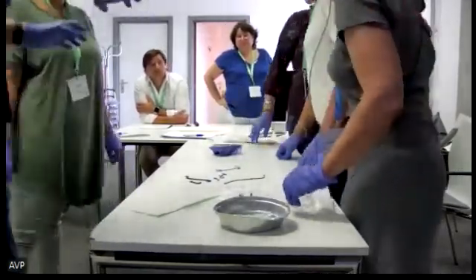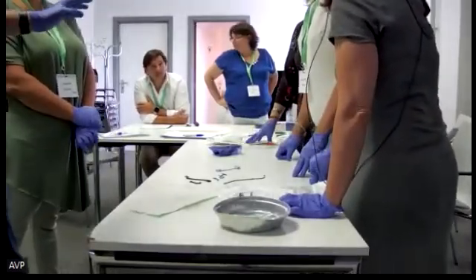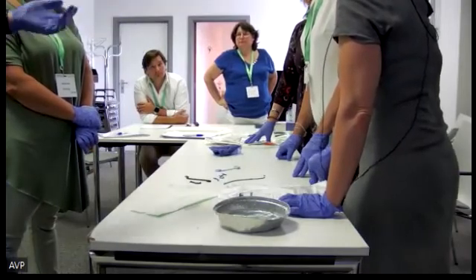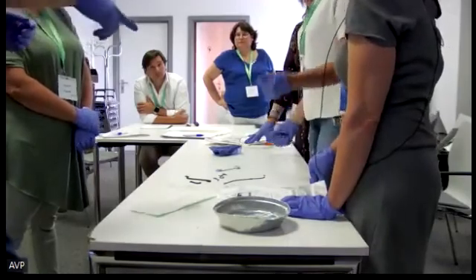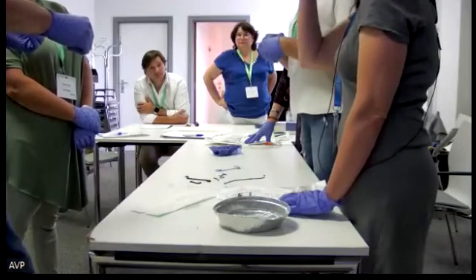When are you using this technique, this story, in order to help the doctor to cannulate the papilla and better work together? It's to go in the right or the left, meaning the torquing.